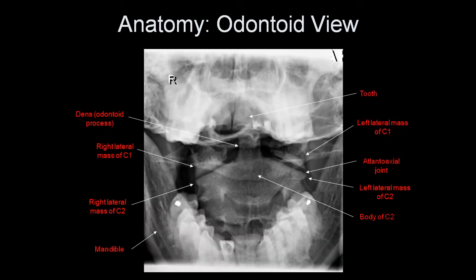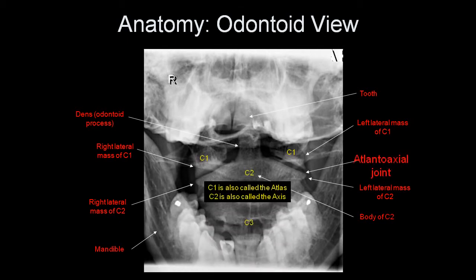On the odontoid view, you can see the teeth, the odontoid process very well, the lateral masses of C1 and C2, the mandible, the body of C2, and the atlantoaxial joints. The atlantoaxial joint is also called the C1-C2 joint. C1 is also called the atlas, and C2 is also called the axis.